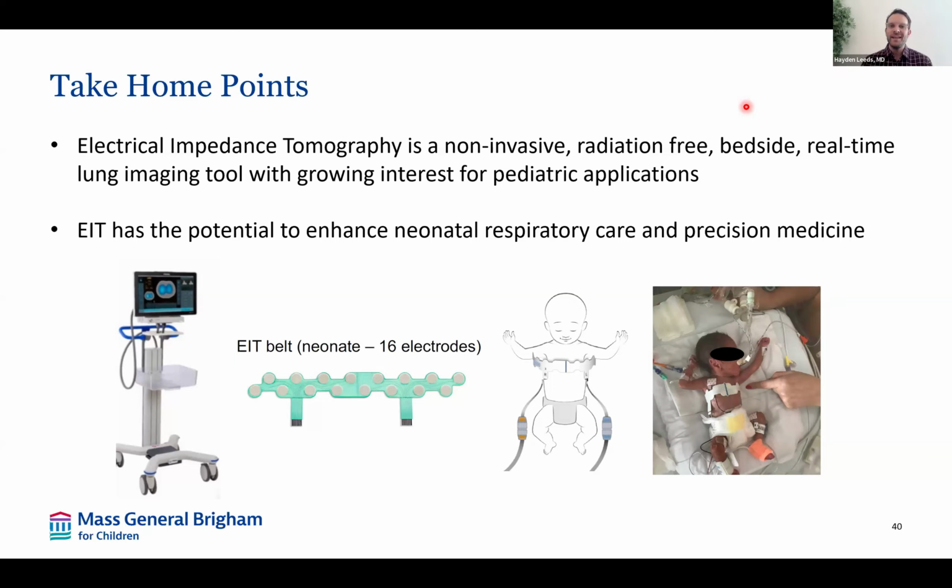Great. I think EIT is great for identifying it in a subset of patients, and then how we manage it is the next question, and obviously deserves more studies. Somebody asked whether there's another tool measuring pendelluft that we have at the bedside for these babies. This will be the only way to know. I think it's been fascinating with a few patients we've had on the oscillator. You can actually see the pendelluft in action, and I know that's been described as a potential mechanism for CO2 clearance in these patients, and you can see it in real time with the EIT, which is really cool.